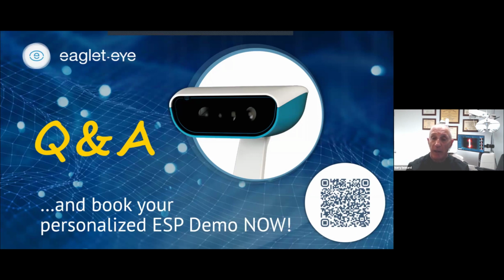We're going to explain to them, we're just going to take another picture of your eye, just like you've done already with the other instruments. The only difference is we're going to put this neat stuff in your eye that's going to make your eye glow in the dark. If they've worn lenses in the past elsewhere or with us before Eaglet, they're going to know what fluorescein is, and they go, oh, that's cool. We tell them, you're just going to sit there, we're going to open up your eyes, and they all find it pretty easy. So we right away will just put that in our workflow.